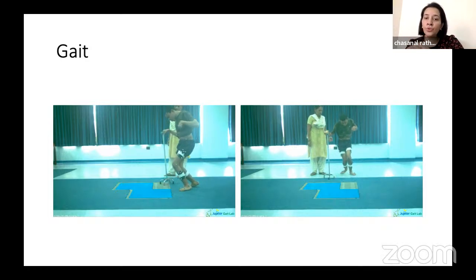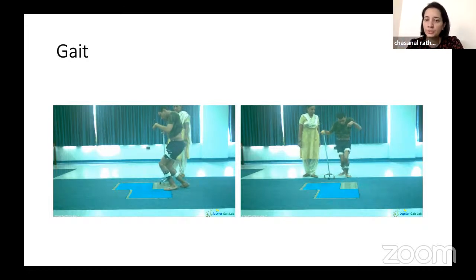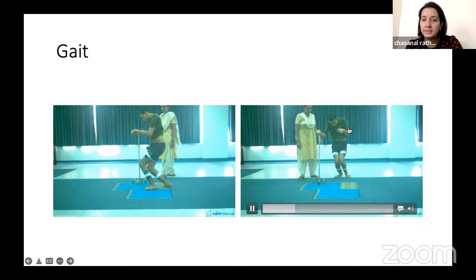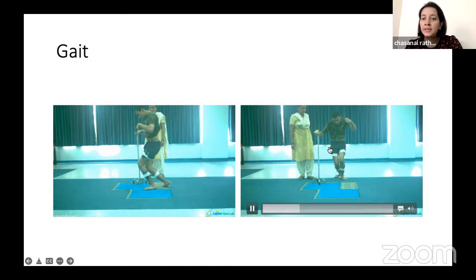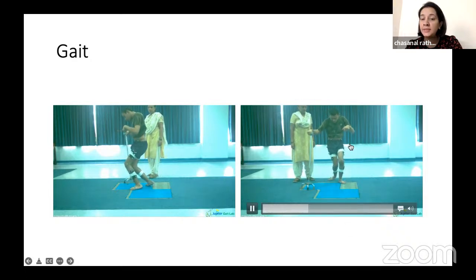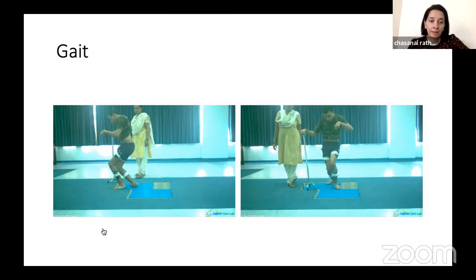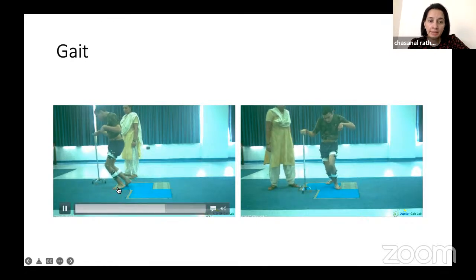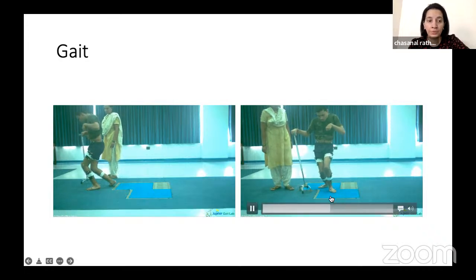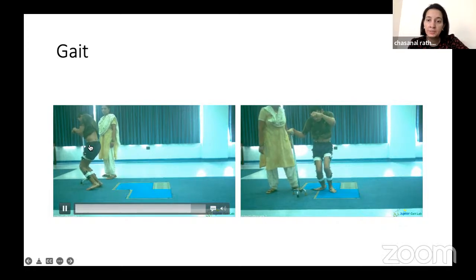And just see how slow the gait pattern is. Just observe. We don't have to reach conclusions very quickly. He holds the hand high to maintain balance. There's a high guard. And we see that the right side is affected much more as compared to the left. He tries to balance a lot of his weight while trying to advance the limb. If we look at the sagittal pattern, the ankles are in dorsiflexion, both. And the left ankle is, of course, also everted outwards. The knee is in flexion throughout, and there's flexion at the hip joint as well.